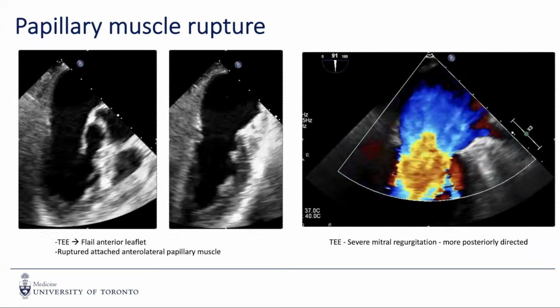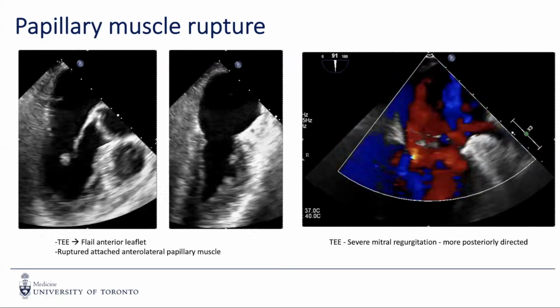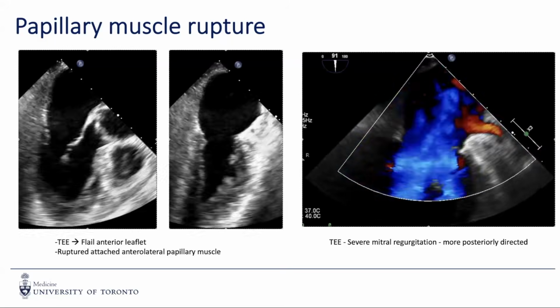Again, same case here. And you can appreciate leaflets being flailed. You can appreciate how the MR is more posterior.